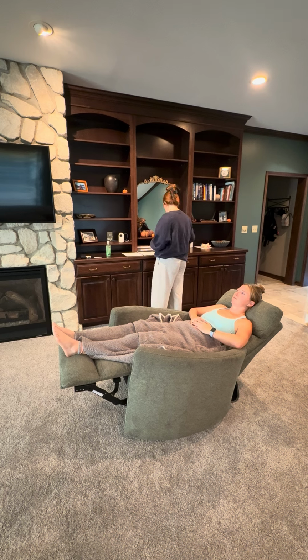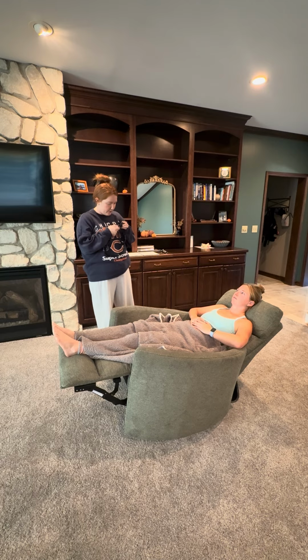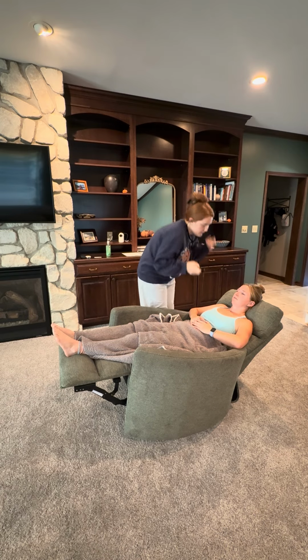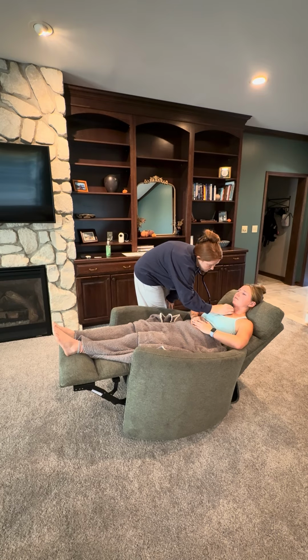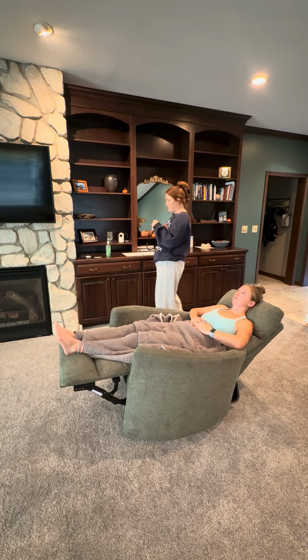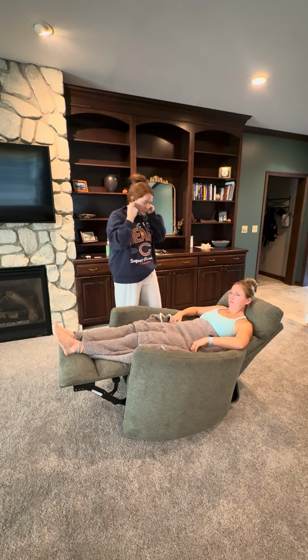And then I'm going to have you hold your breath, and I'm going to use the bell of my stethoscope to listen for any carotid bruits. So if you could just take a deep breath in and hold it. No bruits noted. And then this next portion, I'm going to examine the aortic, pulmonic, tricuspid, and mitral areas, first using the diaphragm of my stethoscope, and then I'll go ahead and switch and use the bell.